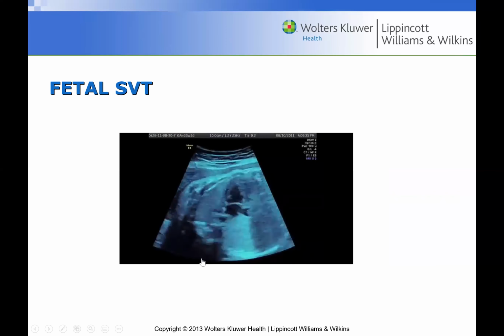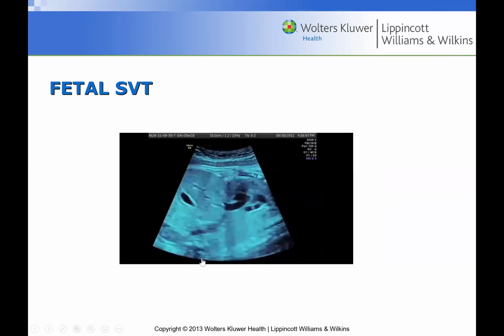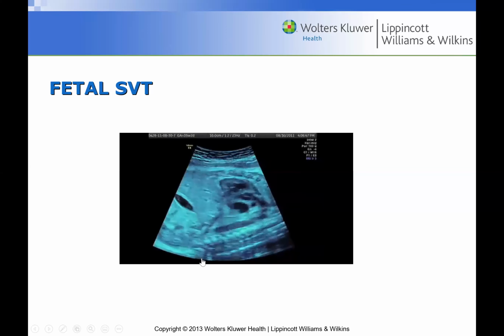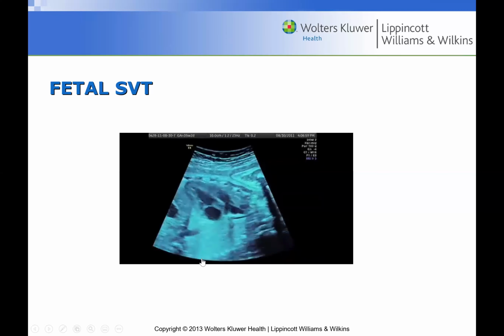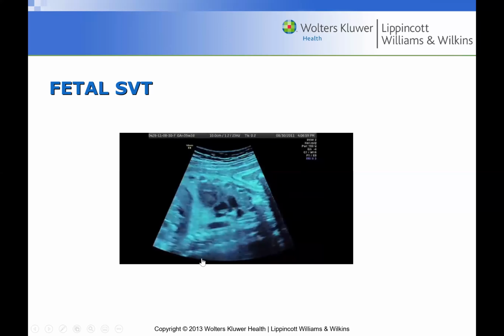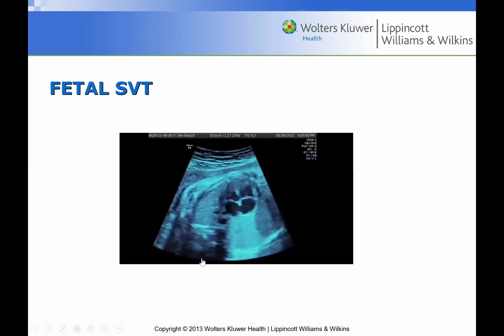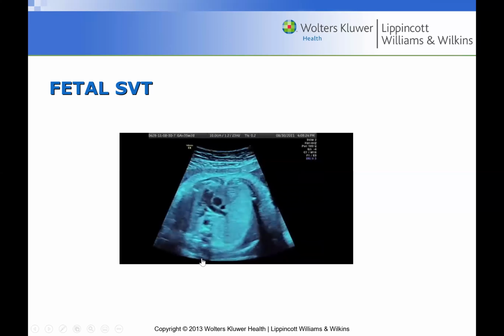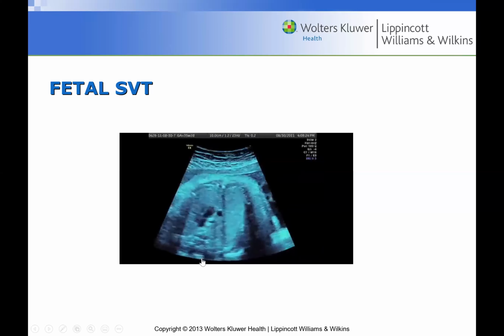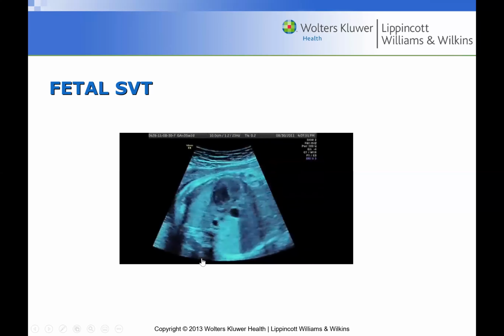Note that there is no hydrops, and yet this is a persistent tachycardia. All the structures of the heart are well seen, just moving too fast.